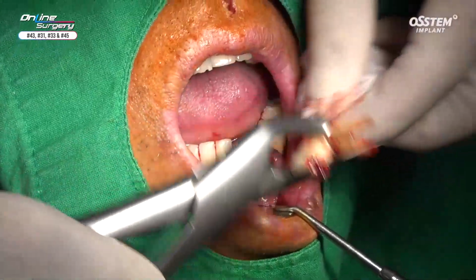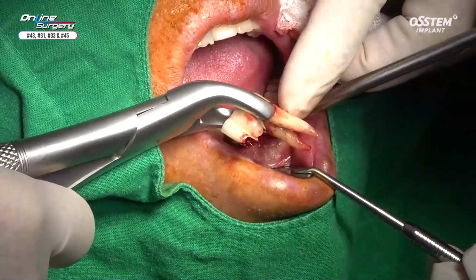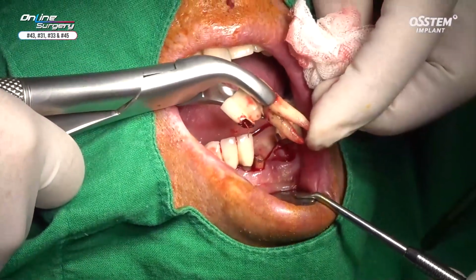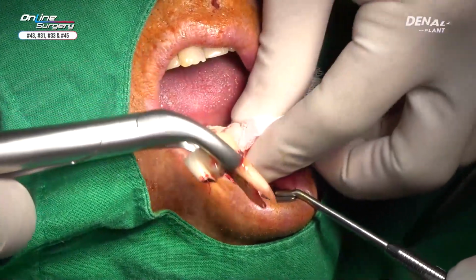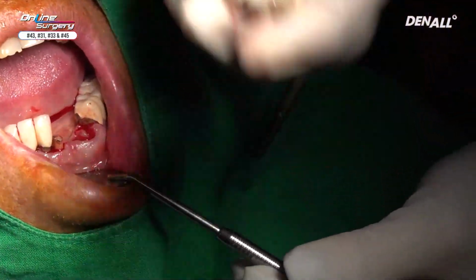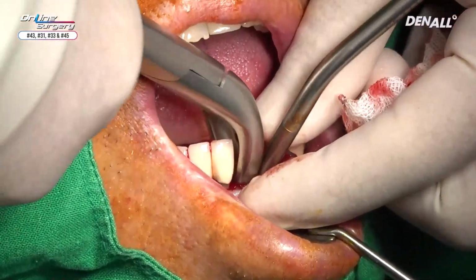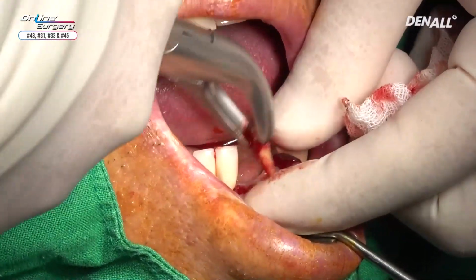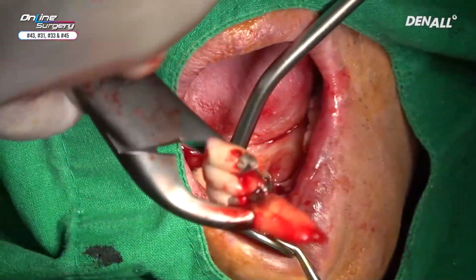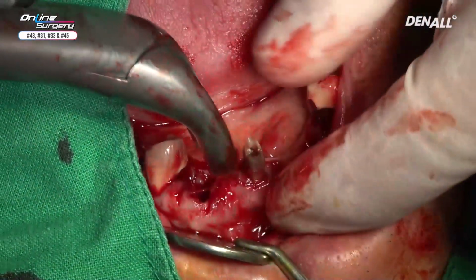On CT, there's two roots. This is canine and this is premolar actually. The shape of the tooth is quite unique. This is buccal. This is not canine but premolar, so transposition occurred. The shape was adjusted so that it looks like a canine, so it's quite a special case. The root is long. Canines have long root.